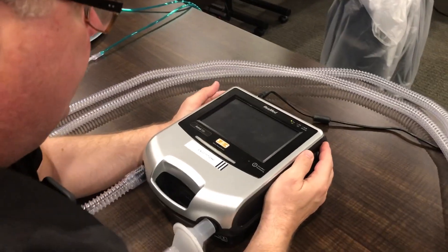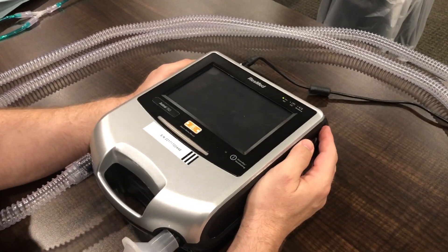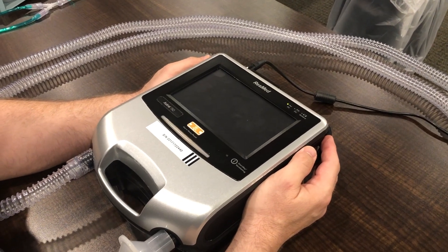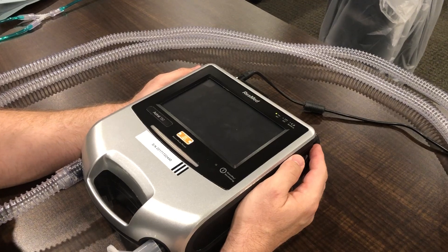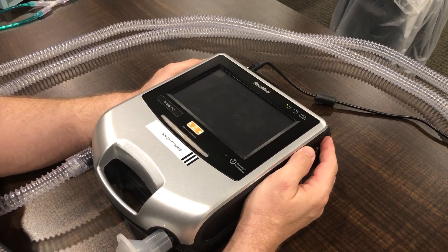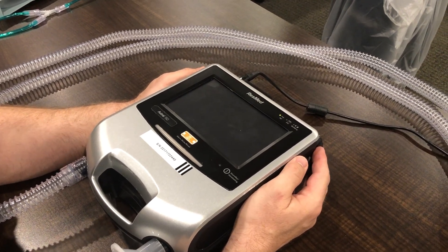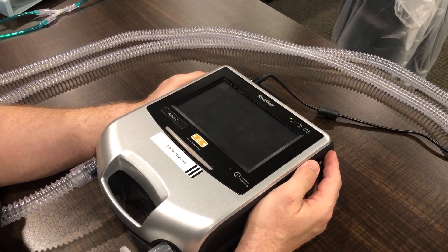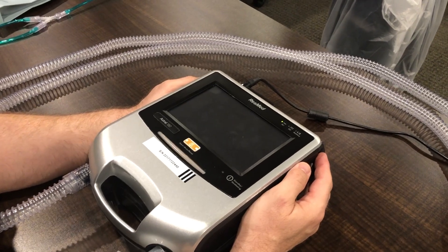Hello, Kelly McGee with VinMed. I wanted to go over the ResMed Astral 150 for a quick demonstration to show that by manipulating the settings on this vent we can in fact achieve inverse ratio ventilation, especially in light of the current situation with many patients rapidly going into ARDS. We think this should be addressed as the possibilities could be a viable solution for these patients.